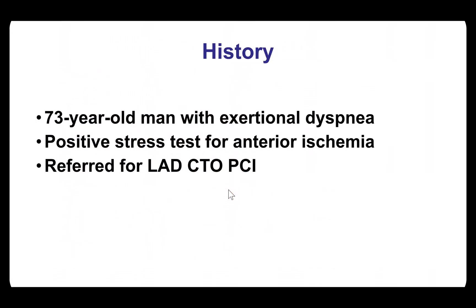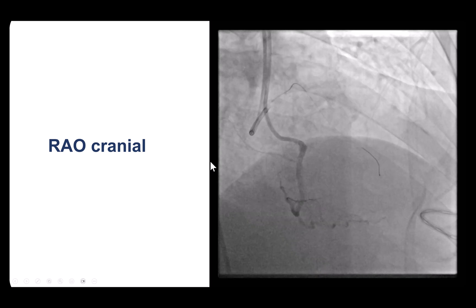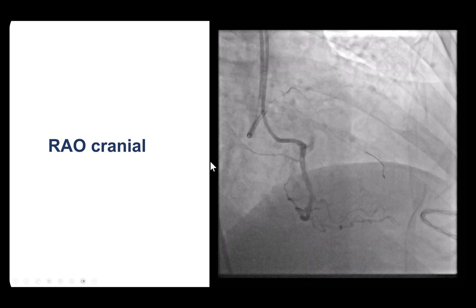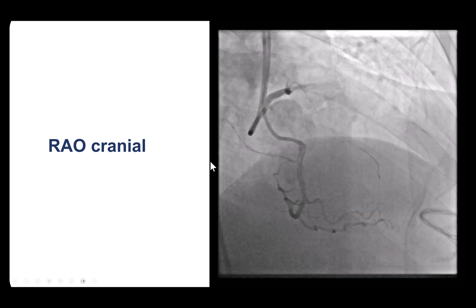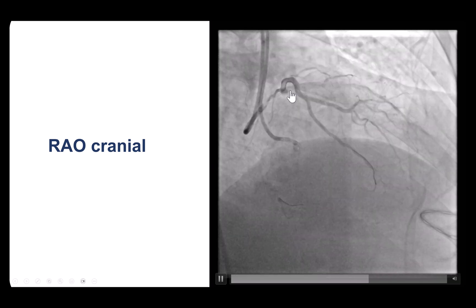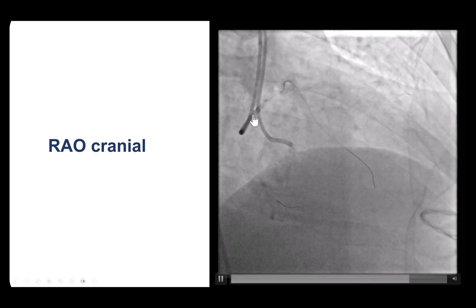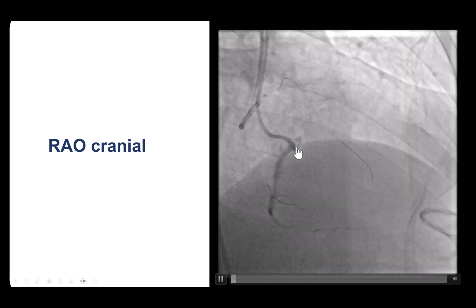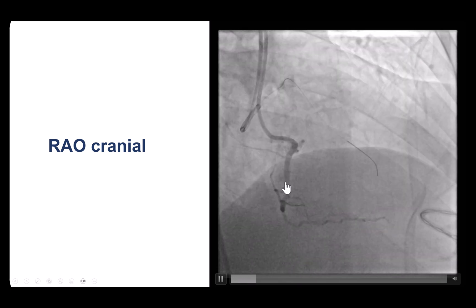Moving on to the case, this was an older gentleman who presented with exertional dyspnea. He had a stress test that showed anterior ischemia, and he was sent for PCI of an LAD CTO that was diagnosed on a coronary CT angiogram. These are the diagnostic angiography images. We have dual injection, injecting first from the donor vessel, the right coronary artery.